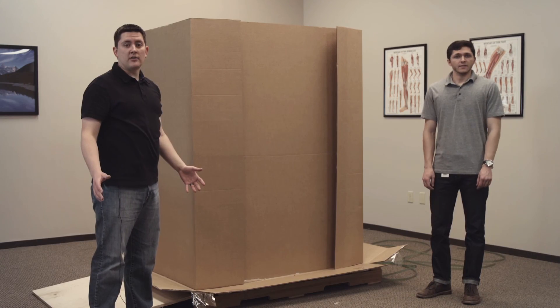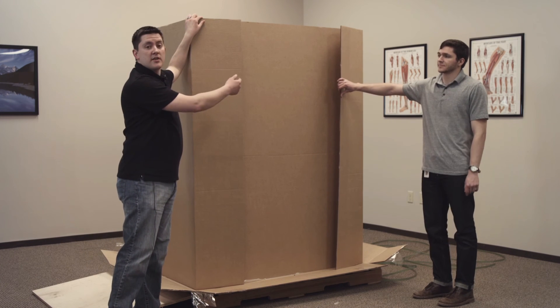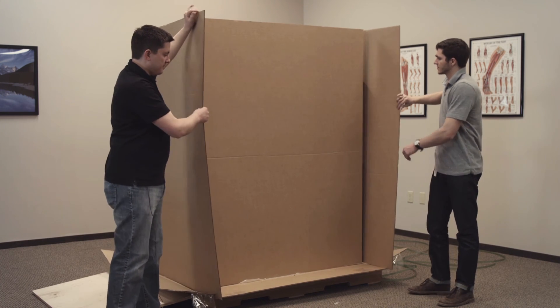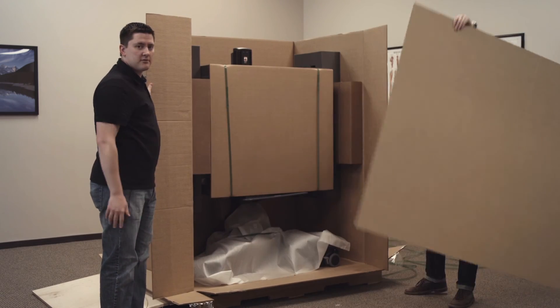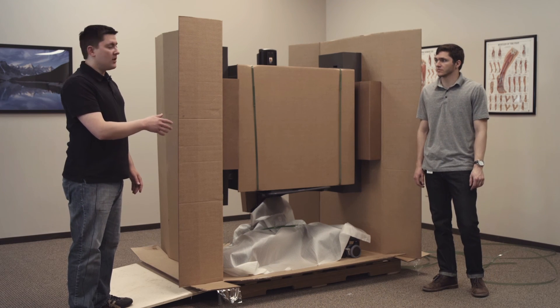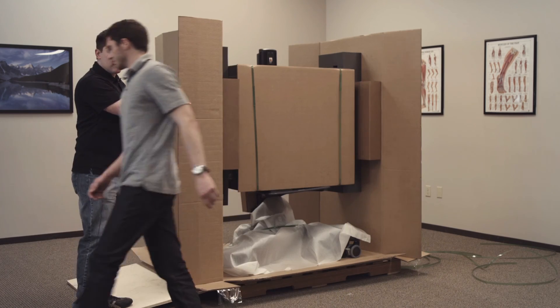Now that we have the outer layer of cardboard off, we're going to take off the other pieces of cardboard, starting with the one in the middle first, because these pieces are supporting the TV with foam. So we're going to pull these out. Now that we have the front and back panels off, we're going to take off the cardboard on the sides that have the foam supporting the TV.